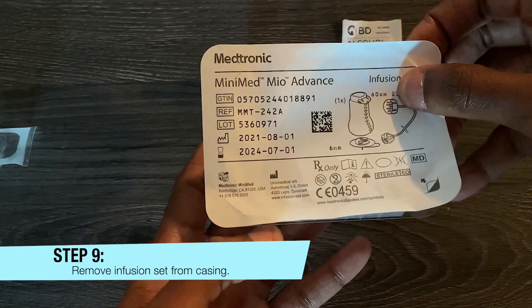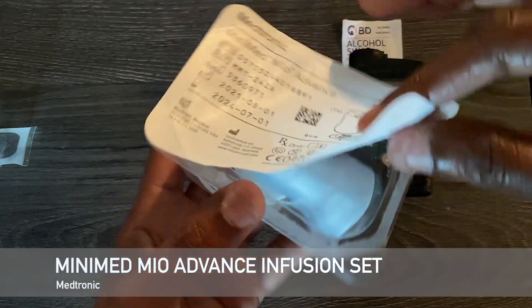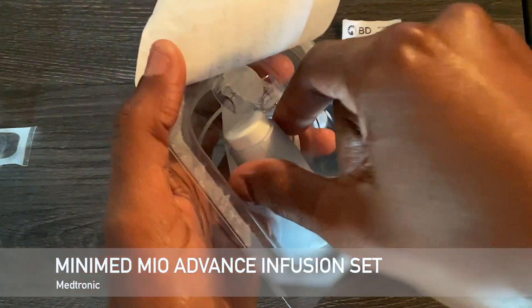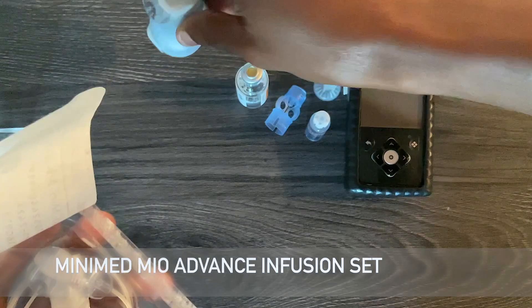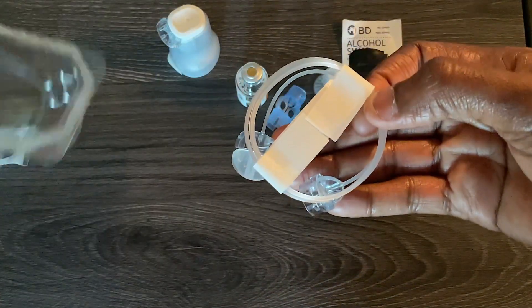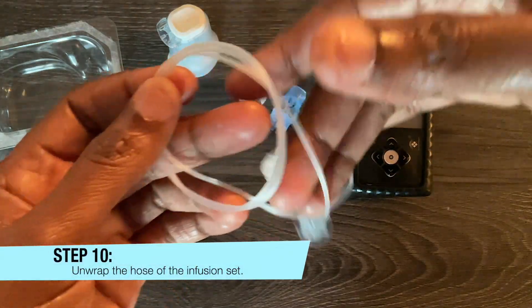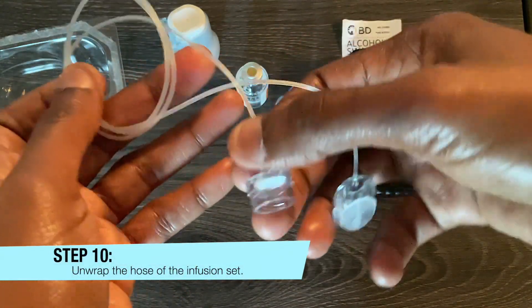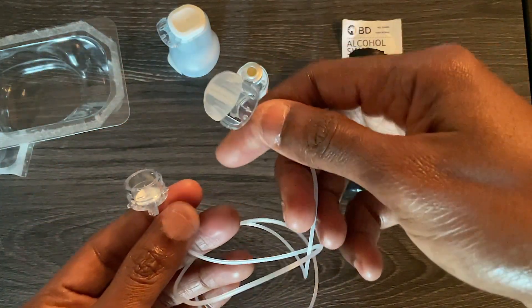I'm using the Medtronic MiniMed Mio Advance infusion set. All I need from this infusion set at this moment is the part that's going to attach to the insulin reservoir. This other part will be attached to my body.